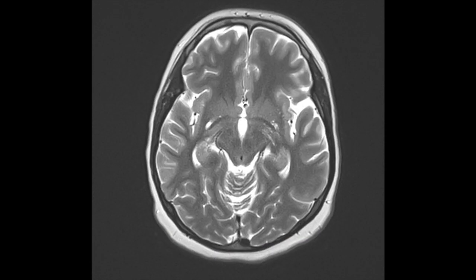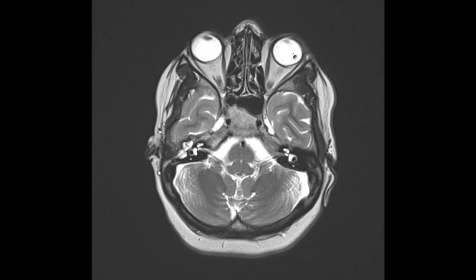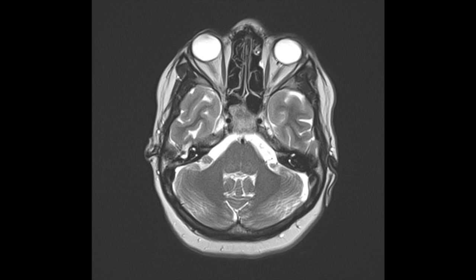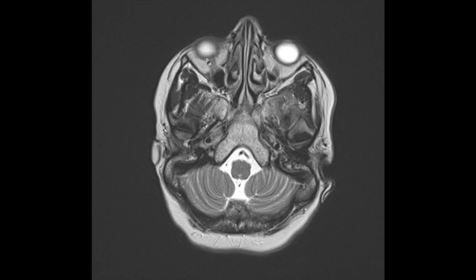Finally, we'll go through the orbits. Here we have the right and left orbits — coming superiorly we have the superior rectus on both sides. Coming down we see the optic nerve, and the lateral and medial rectus, as well as the inferior rectus.